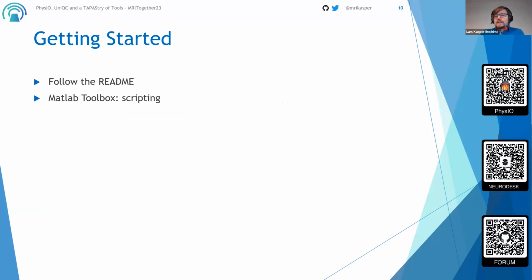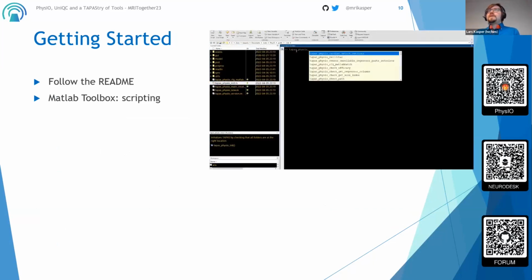If you want to get started with PhysIO, the easiest way is to use MATLAB and then just follow the README. You can download and initialize it. Let's show you a little video.